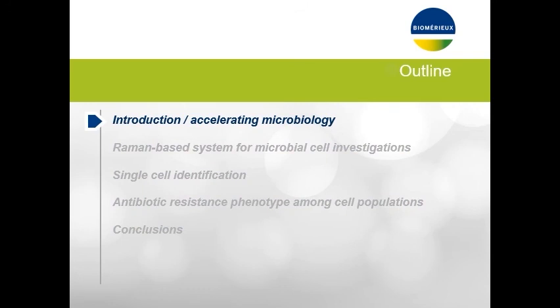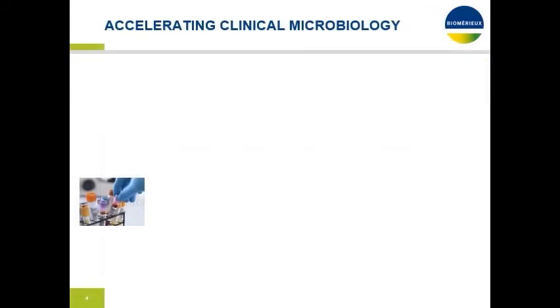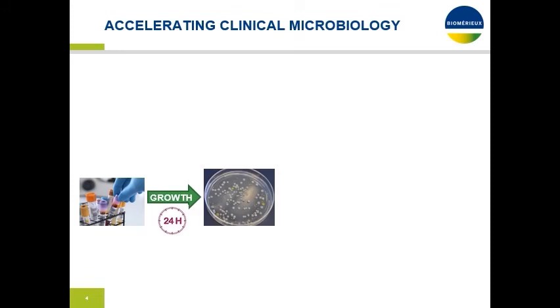So first, an introduction to the clinical microbiology context. So we are at the level of clinical microbiology labs. When someone is suspected of having an infection, a sample is taken, so blood, urine, anything. And what happens in clinical microbiology labs, classically, is that this sample is spread onto a solid growth medium. And the whole is incubated until each bacterium of the initial sample has grown to a colony, so that's 10 to the 8th, 10 to the 9th clonal individuals from the initial bacterium. And then one or several of those colonies are chosen for subsequent identification or susceptibility testing.